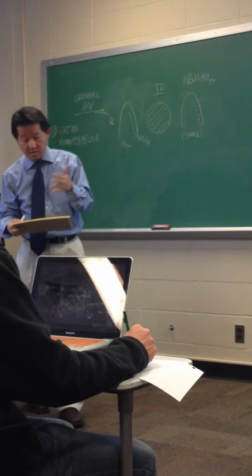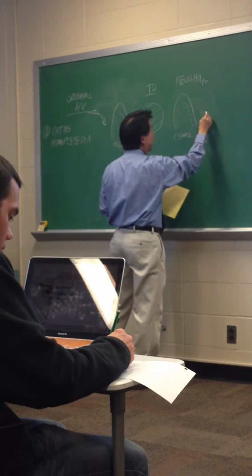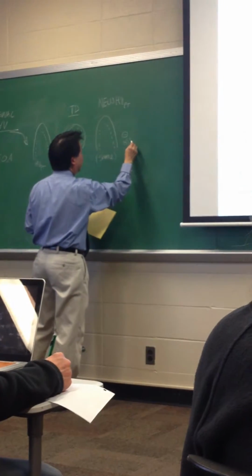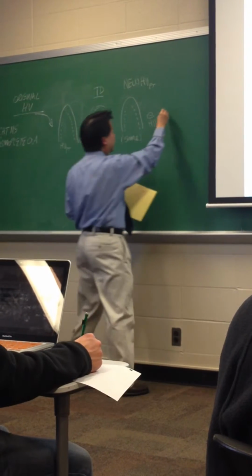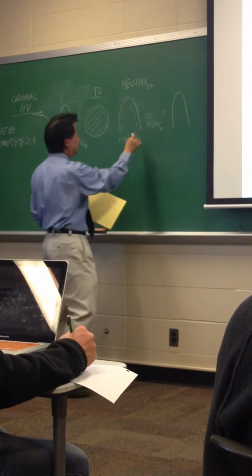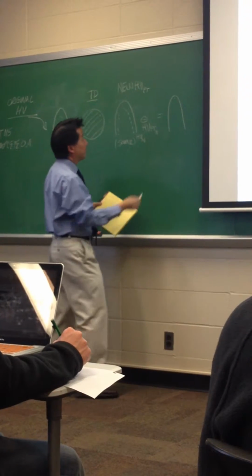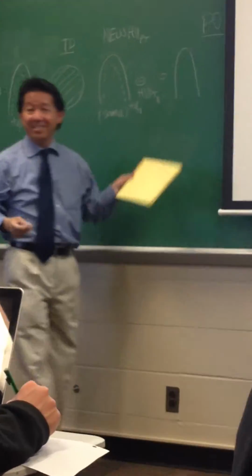The mean sensitivities are already the same. And then it just subtracts the SAP. So you minus that new thing out of there, and what you're left with is this, which is the original age-matched norm.